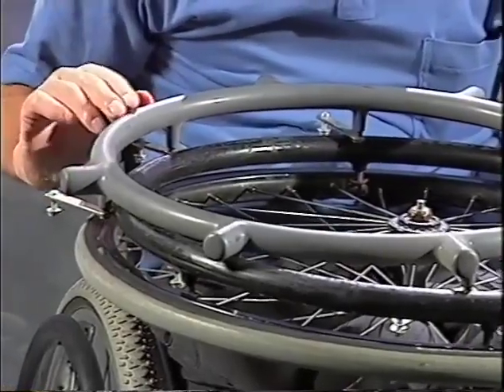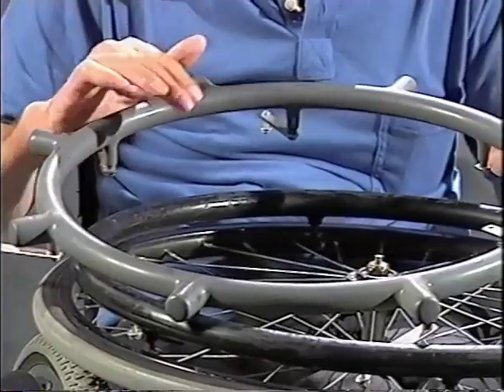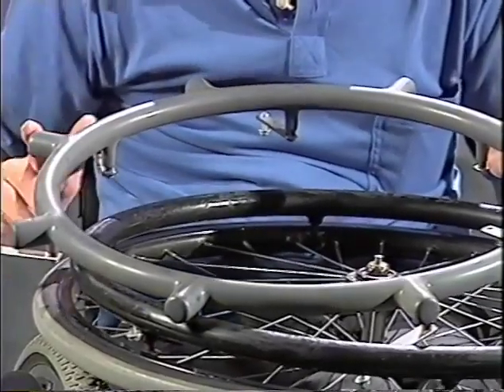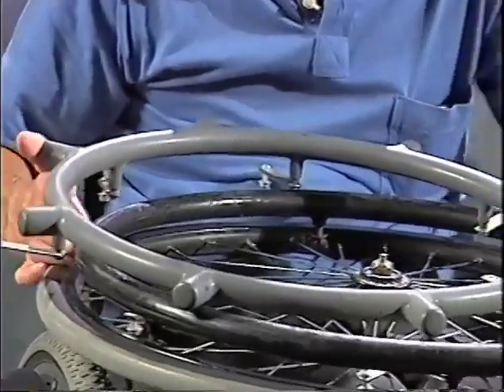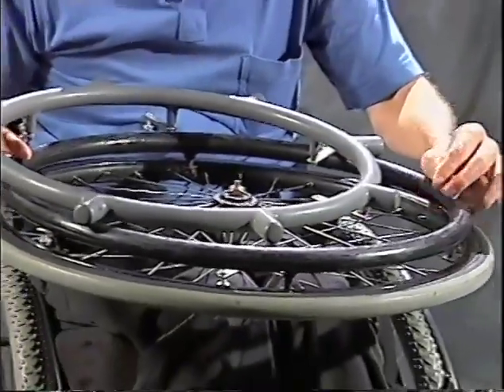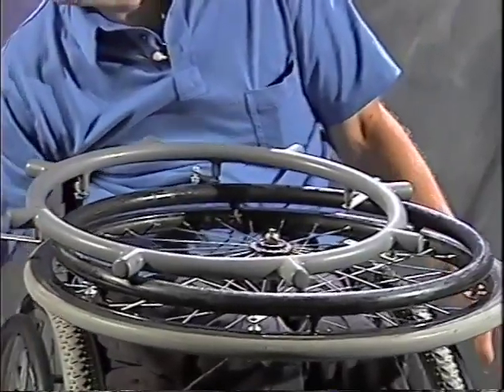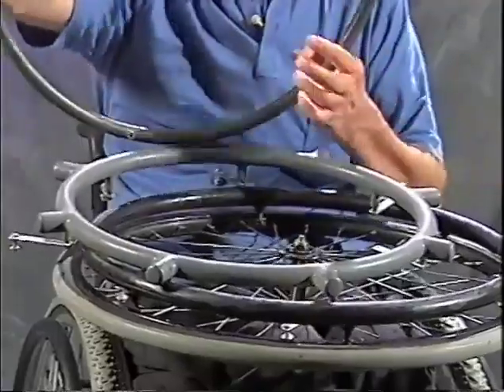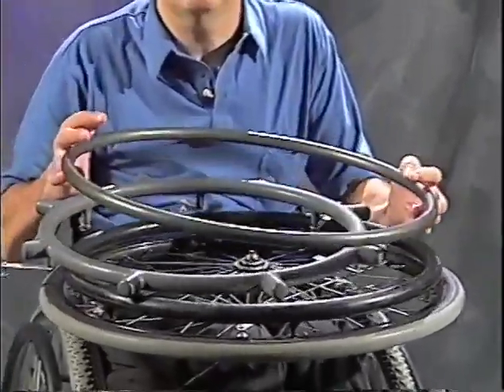This is a plastic-coated projection hand rim, which gives you kind of an intermediate between just projections and the plastic hand rim. The plastic hand rims are high friction, and they all have their benefits, and then there's the simple, plain-coated aluminum hand rim. Each one has their place.